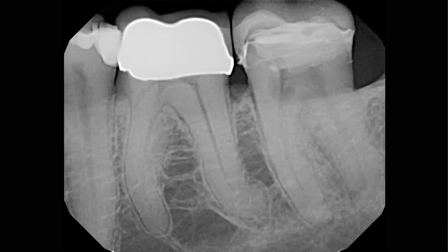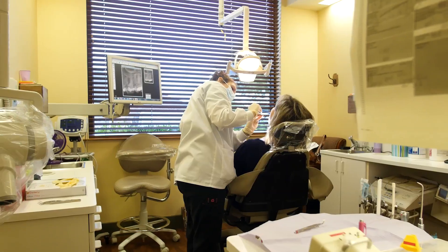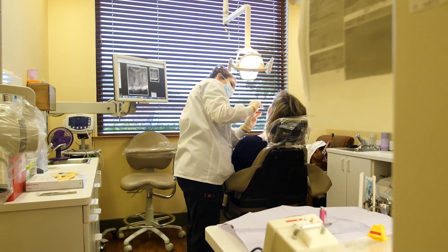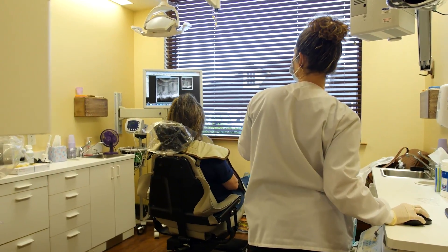This patient presented with a long-standing history of pain and thermal sensitivity from the number 18 region. The tooth was recently prepared for a crown and the symptoms did not improve following the restorative work. On examination, number 18 was sensitive to percussion and palpation with a lingering and painful response to cold testing. The periodontal pockets were within normal limits and there was no tooth-sleuth sensitivity. Radiographically, the apical bone was unremarkable, but there was an area of resorption in the chamber. Clinically, there was no evidence of the resorption, and the angled radiograph indicated the resorption was inside the chamber. The clinical findings were consistent with the diagnosis of an irreversible pulpitis with symptomatic apical periodontitis.